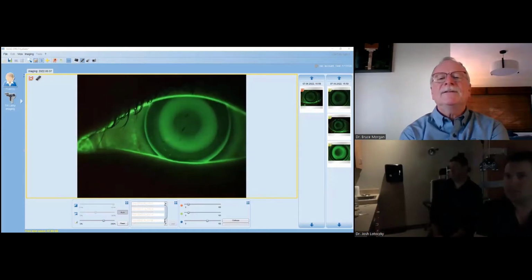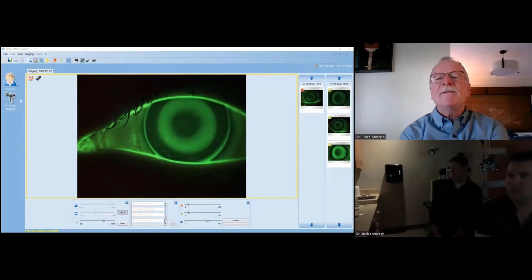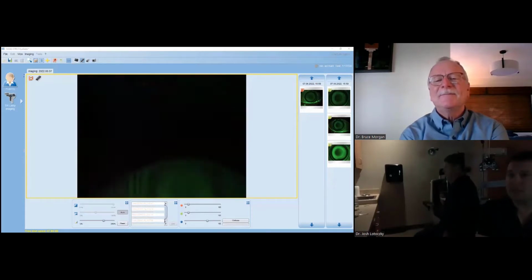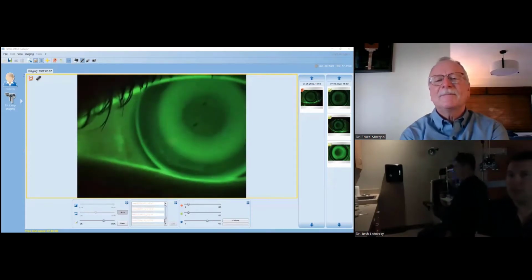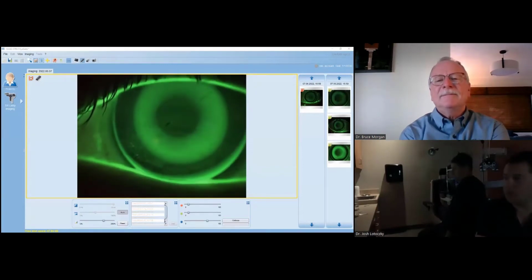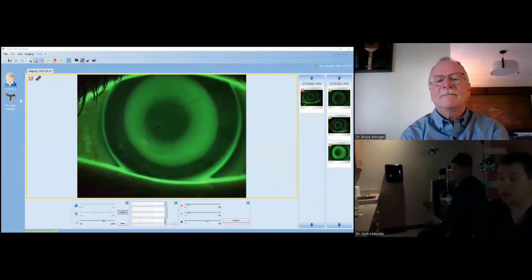Yeah, and like you said, it's not a real distinct treatment zone either. So we're probably definitely off the cornea more than that 7 to 10 microns that would be more ideal. Right, it's fuzzy. But it is amazing to see the difference that you get just by sitting and watching it or having it sit for a little bit.